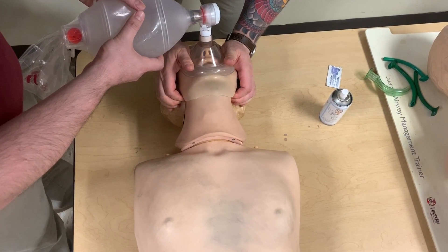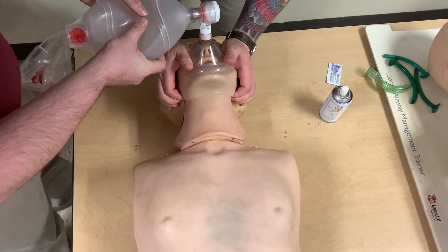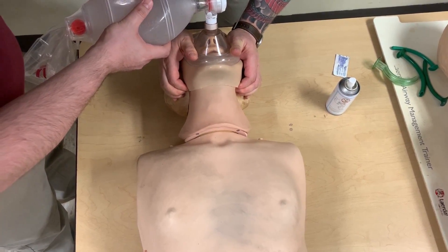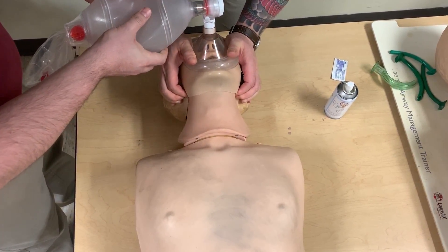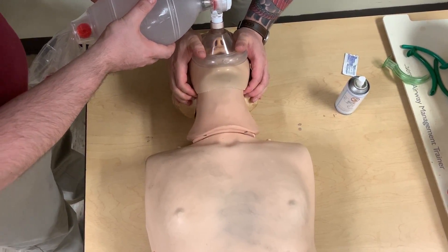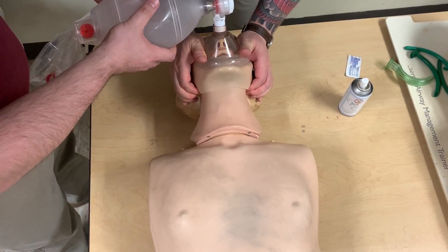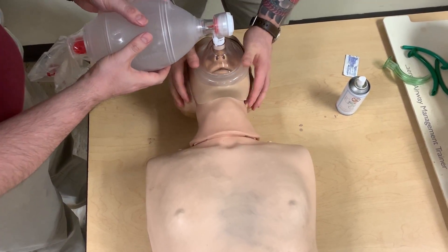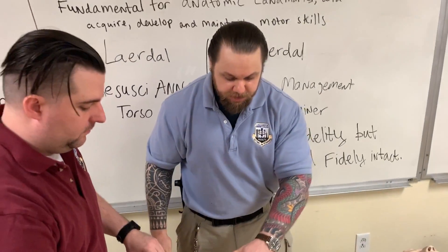My partner goes ahead and squeezes. I see chest rise. Two one thousand, three one thousand, four one thousand, five one thousand, six. If you notice what I'm doing, I'm engaging on five and my partner squeezes on six. Two one thousand, three one thousand, four one thousand, five, six. This is how you want to train your novices to ventilate a person on this mannequin first.